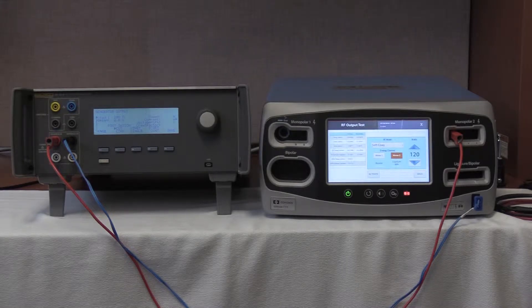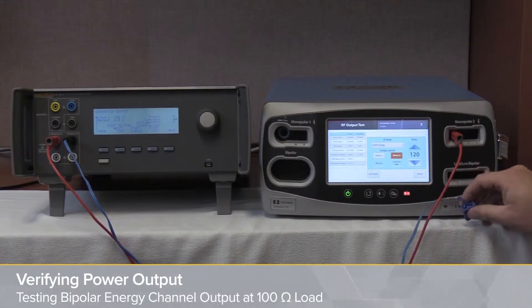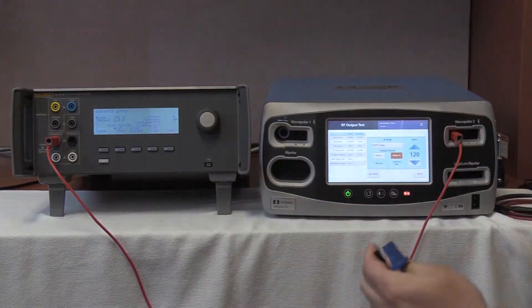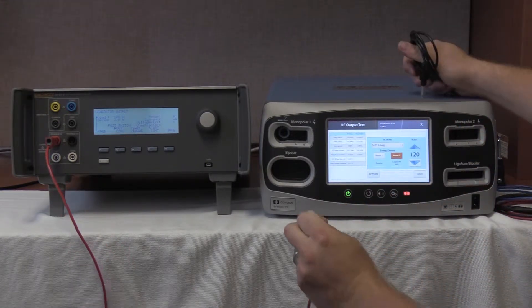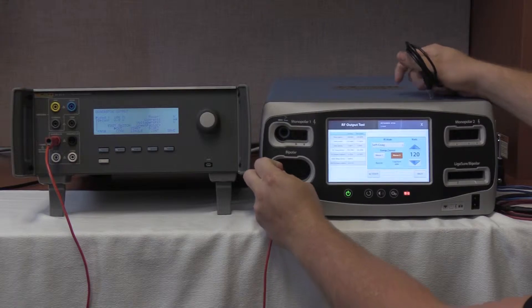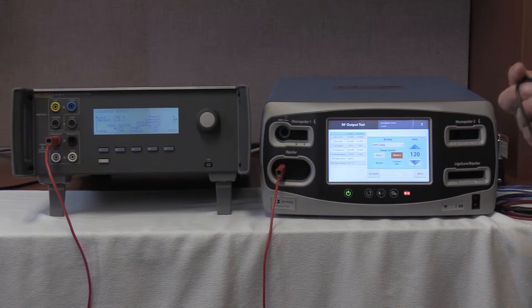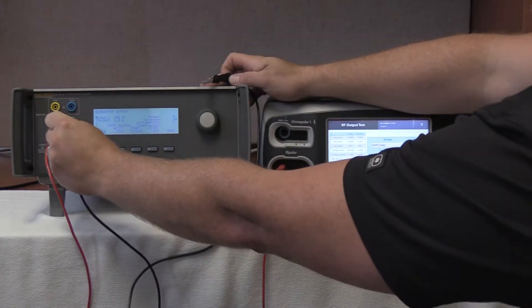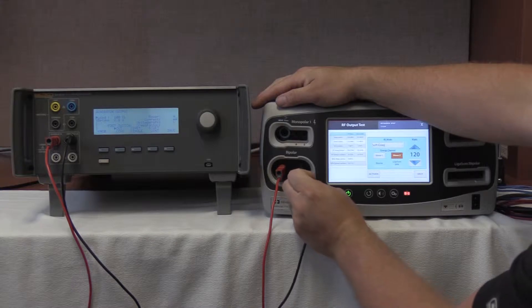We are now going to test the bipolar energy output of the Valleylab Covidien FT10. In order to do so, we are going to disconnect the cable hookup used prior by removing the REM adapter cable. Once removed, we are going to take our variable high and place it into the leftmost port of the bipolar output of the FT10. Then we will use our black banana pin cable and plug into the QES3 and into the rightmost port of the Valleylab Covidien bipolar output.